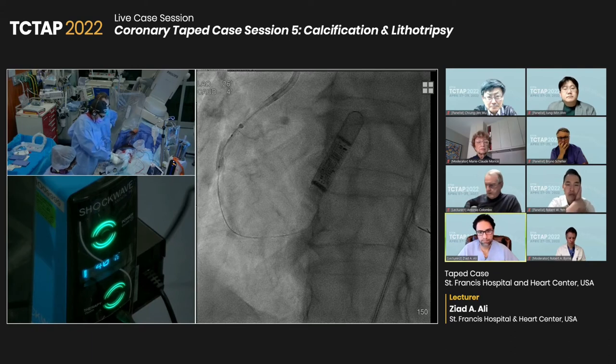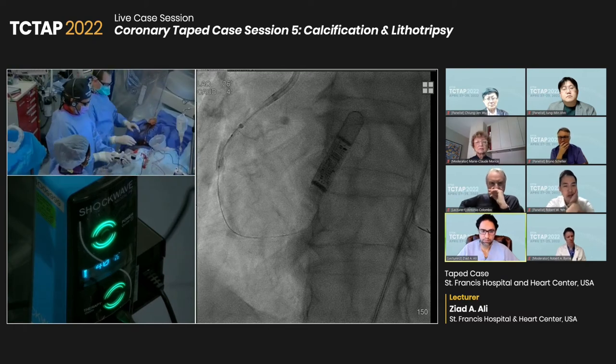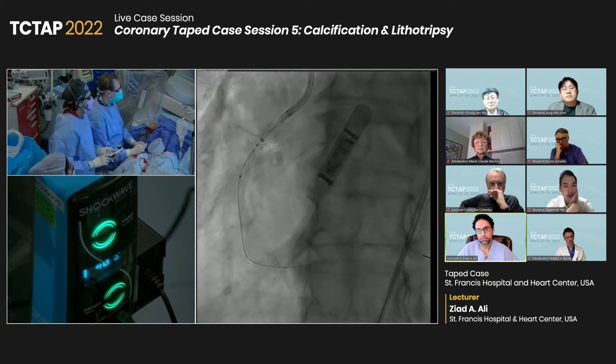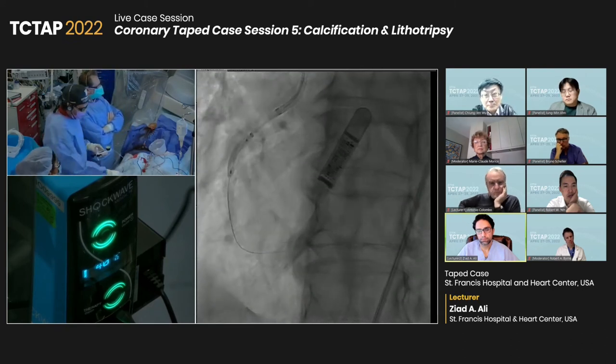Wow, you're really working hard here. Okay, so you can see I'm really going negative to suck back. But it just goes to show how important the prep for this device is. All right, so let me just come back a little bit. I like it. So now the more distal emitters are right on.